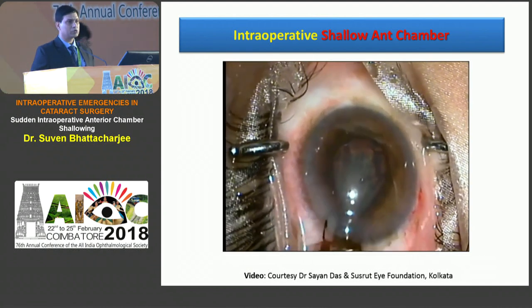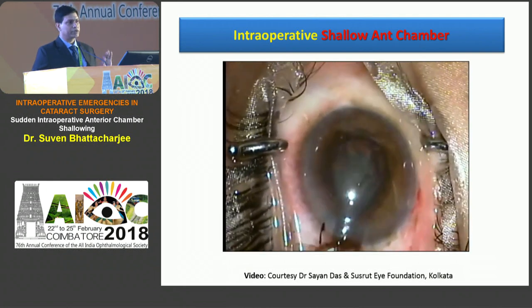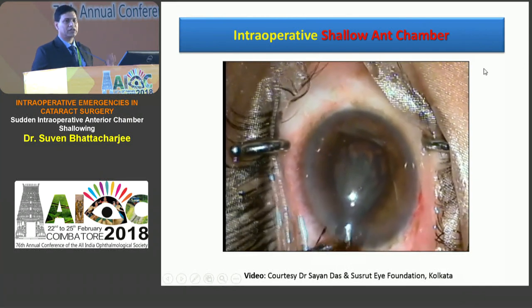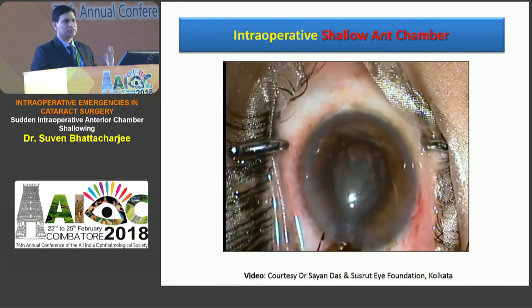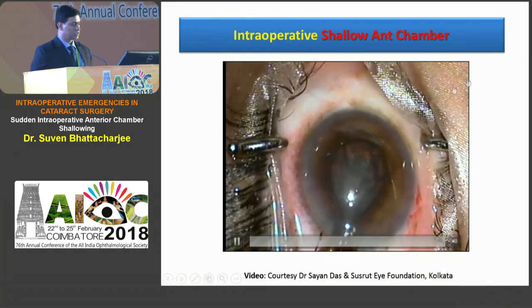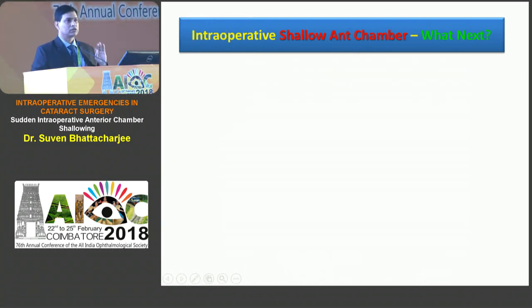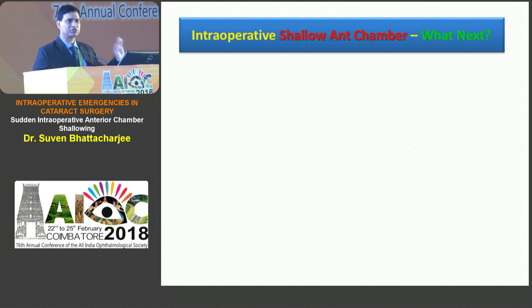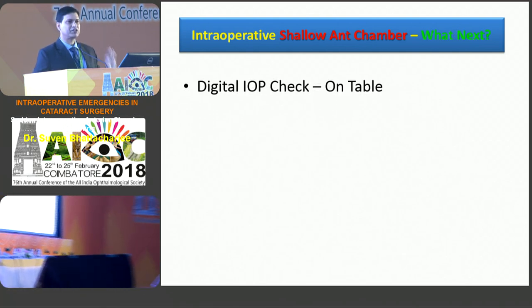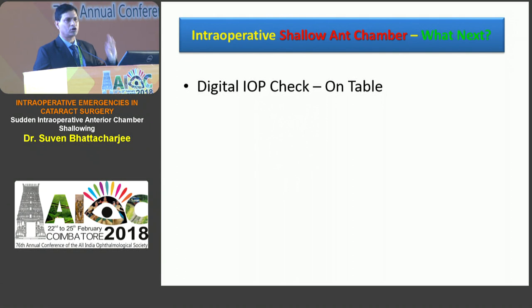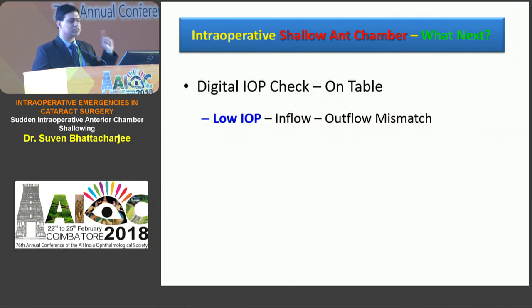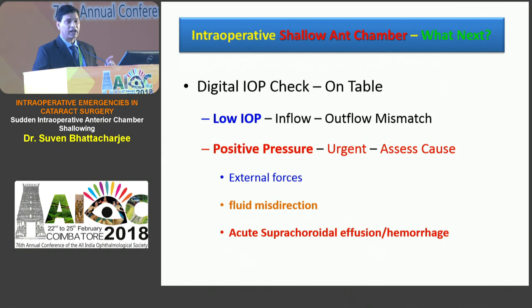No amount of repositioning is going to help at this point. This is when we need to take a call. We have a shallow anterior chamber and the iris is prolapsing. The first thing you need to do is check the pressure of the eye — whether it's soft or hard. That is the key to the next step and how big a trouble you are in. If it's low, there's an inflow-outflow mismatch that needs to be corrected. If it's high, it's called positive pressure — it needs urgent attention and you need to assess the cause.